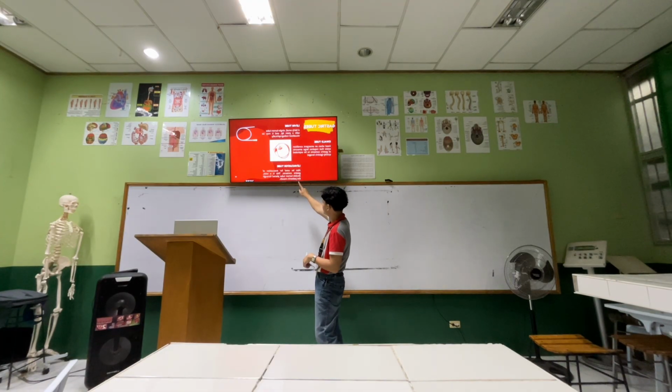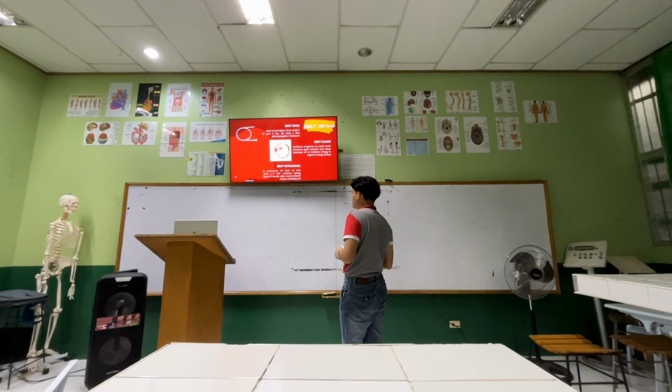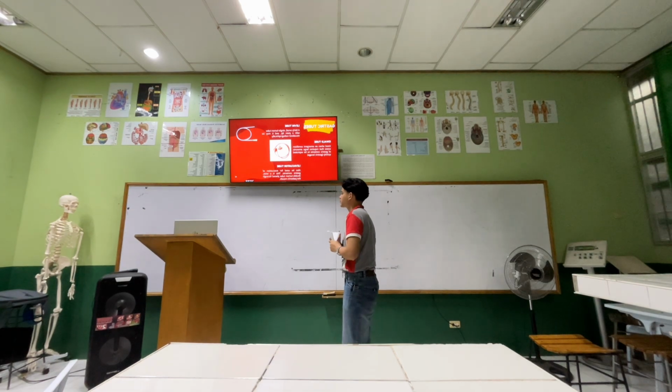And then we have the Levacuator tube, also used for evacuation of gastric contents. This is a wide double lumen tube placed through the patient's mouth.